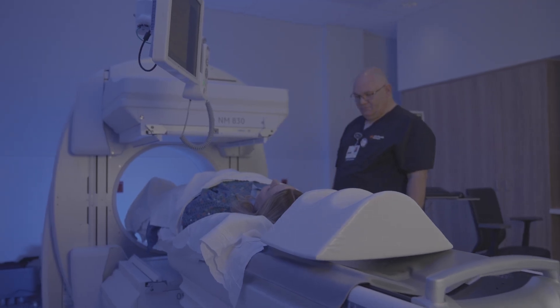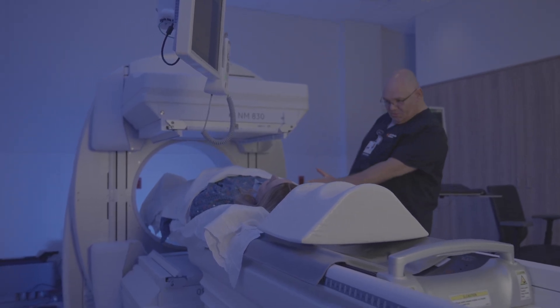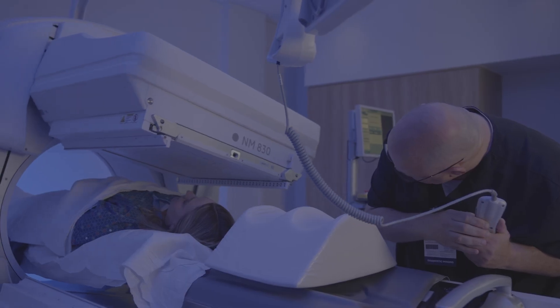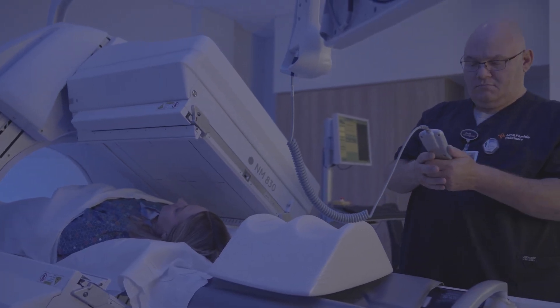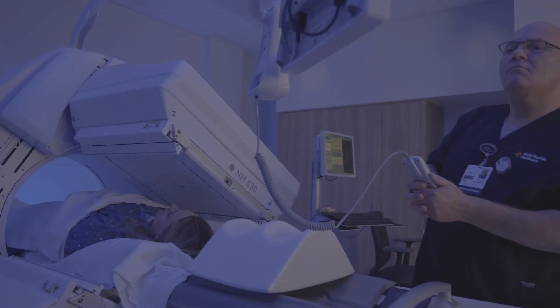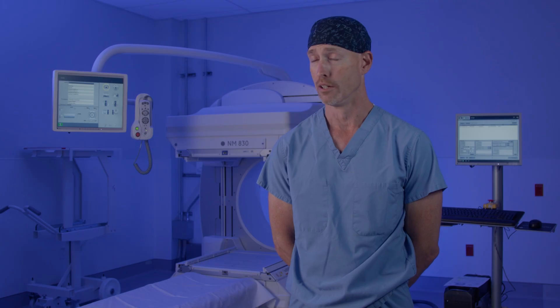The patient for this scan is given a small dose of a radioactive isotope that's very low dose and out of the system very quickly. People who are concerned about having reactions, like if they have an allergy to iodinated contrast for CT scans, there's no concern about that for this type of scan. There's no cross-reactivity, and I've never in 20 years had a patient have a bad reaction to the radiopharmaceutical that they're given.